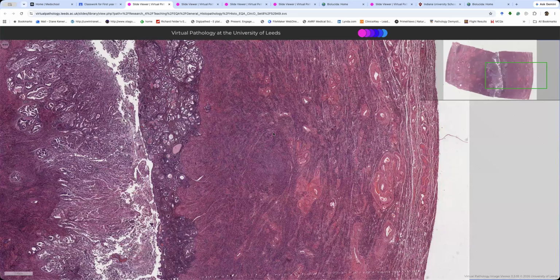The other thing that you will be learning to do is look for lymphovascular space invasion, but that is quite tricky, and we're going to move on. All right, so grade, stage, how to tell it from atypical hyperplasia. Yeah, have we got those down pat?